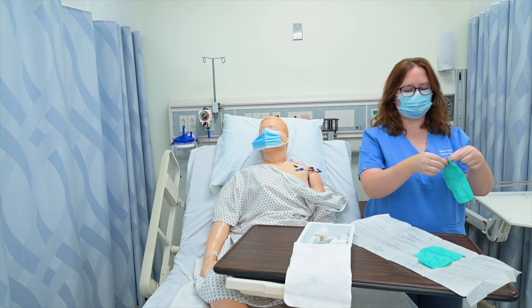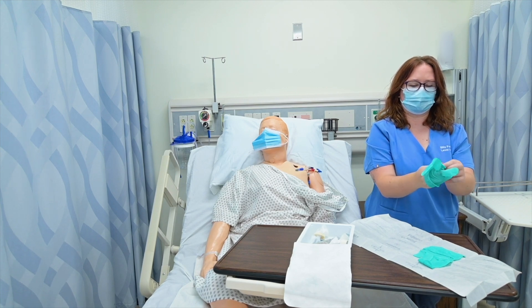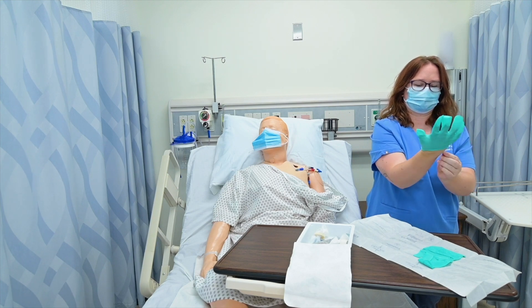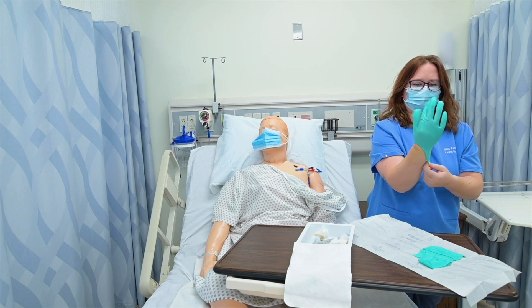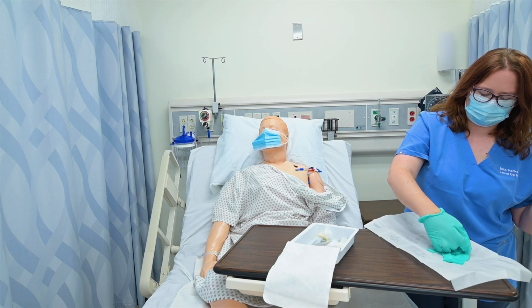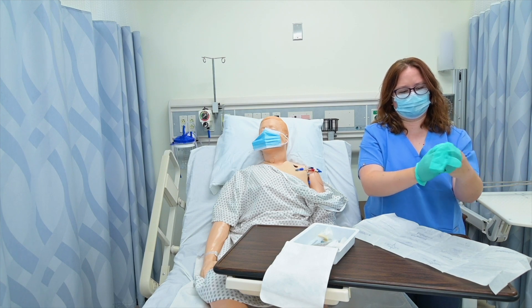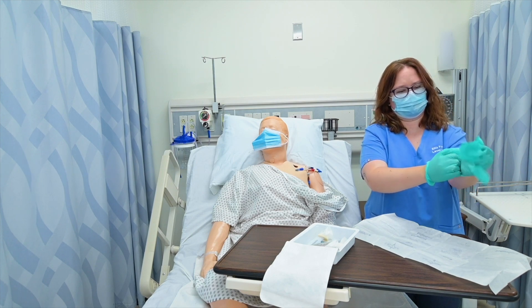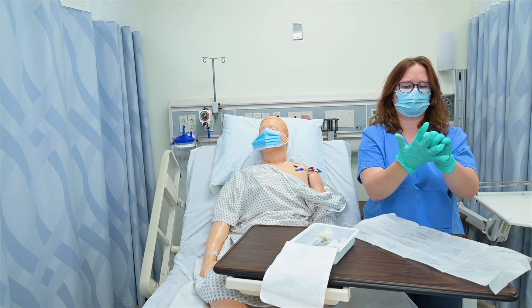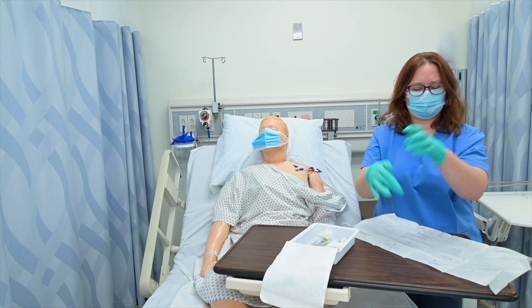As always, I pick up my dominant hand glove with my non-dominant hand first. Then I slide my fingers in under the cuff of my non-dominant hand. I'm just going to fix my thumb a little bit, and then I can slide my wrapper off into the trash can.